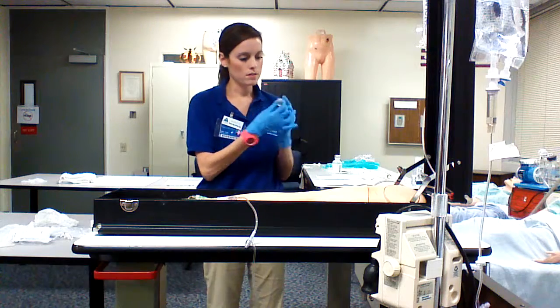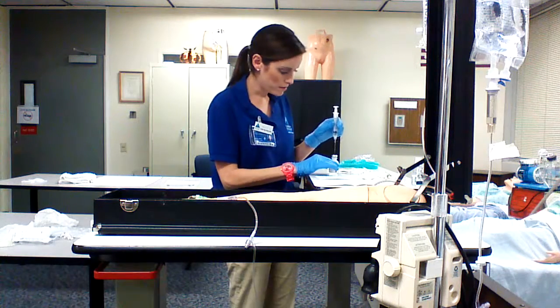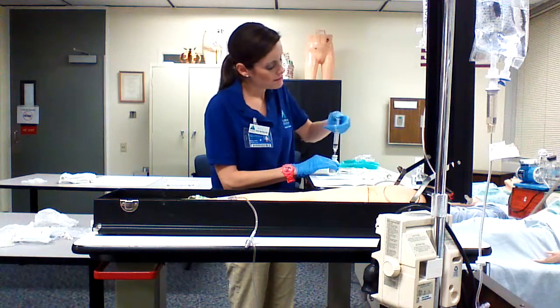So again, I'm going to draw up 2 milliliters of vancomycin.